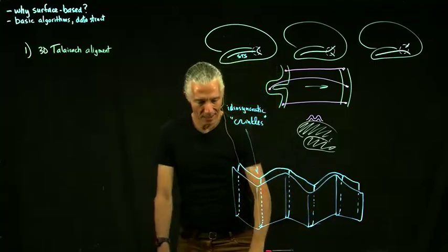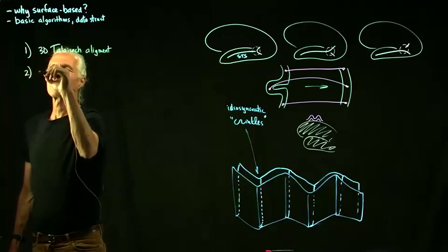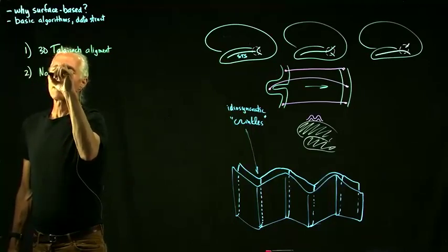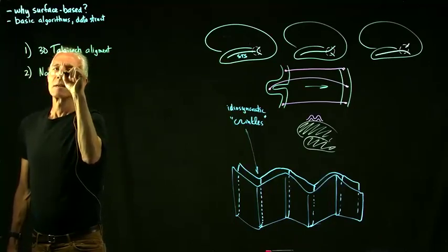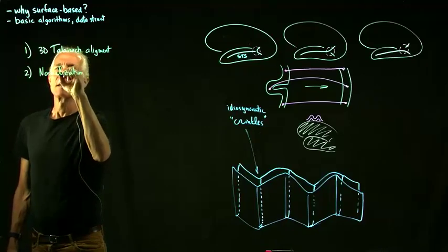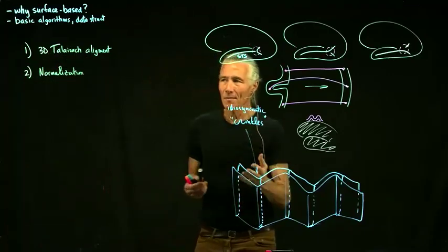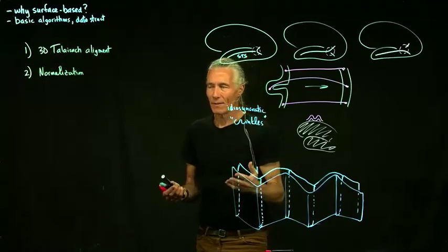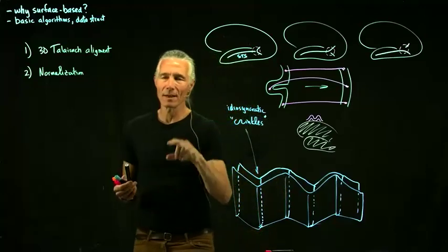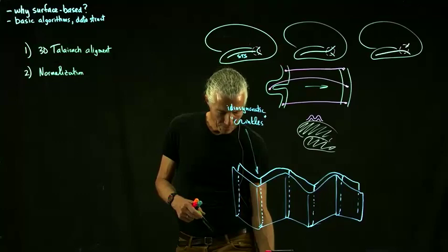But if we want to actually get the surface, one of the first big problems, especially when we don't have quantitative scans, is normalization. And what's the problem here? Well, the scan brightness might vary by like 50%, but we're looking for like a 10% difference between the gray and the white matter.